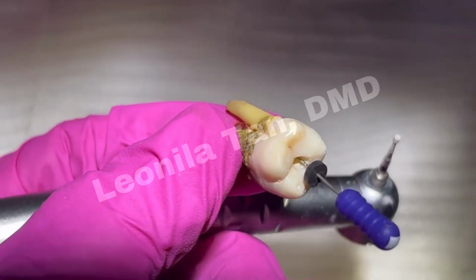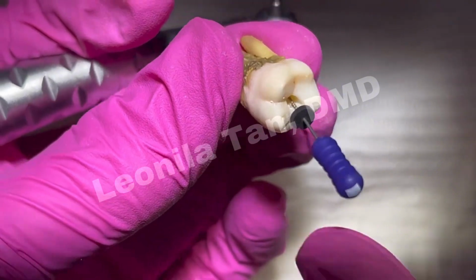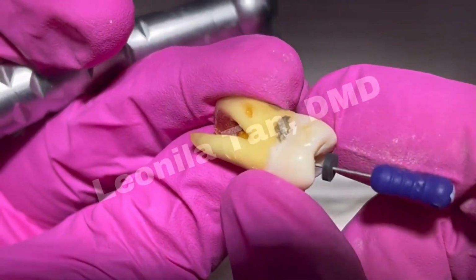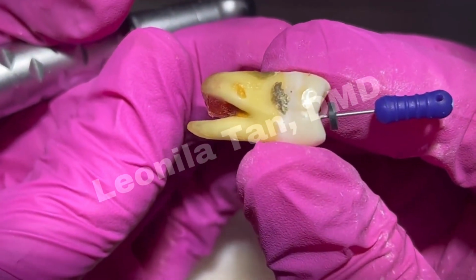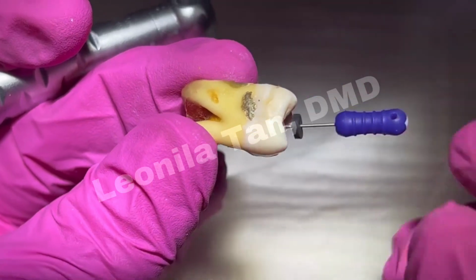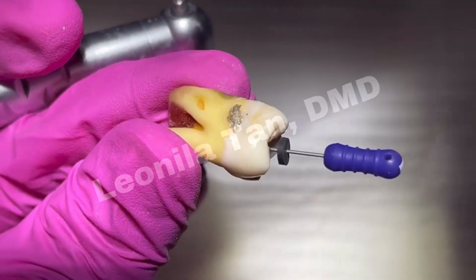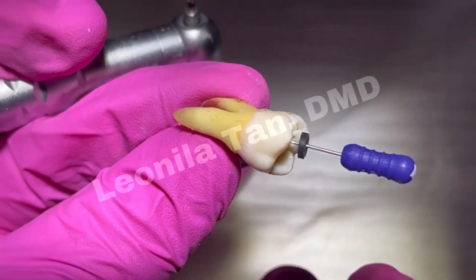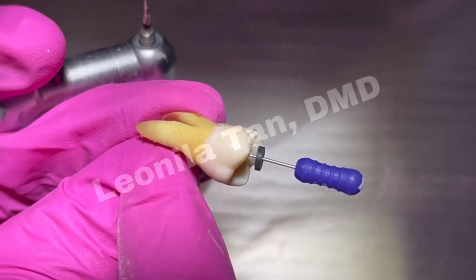Notice the direction of the file. It is directed towards your palatal area, just like you had in your drawings. Please remember that. Do not direct it towards your buccal. Always the palatal. The rule is: locate the bigger part of your chamber and the bigger canals first.